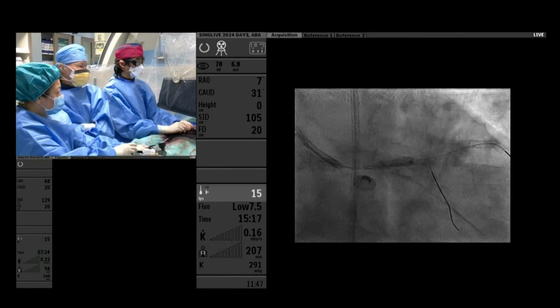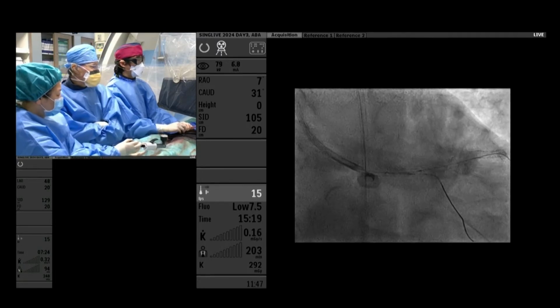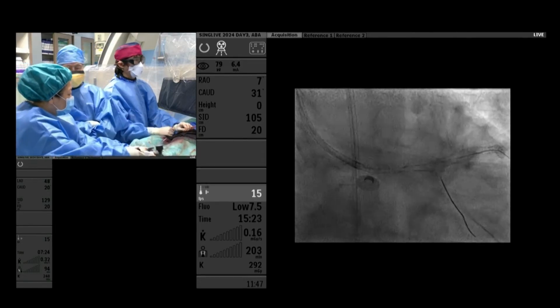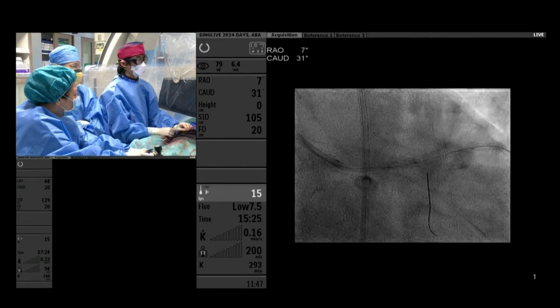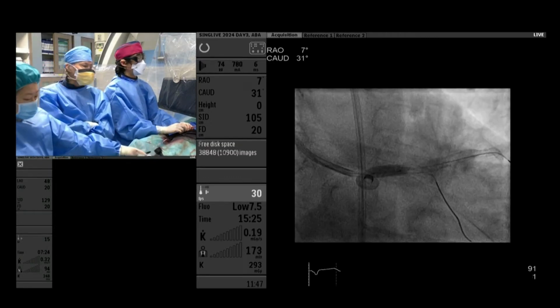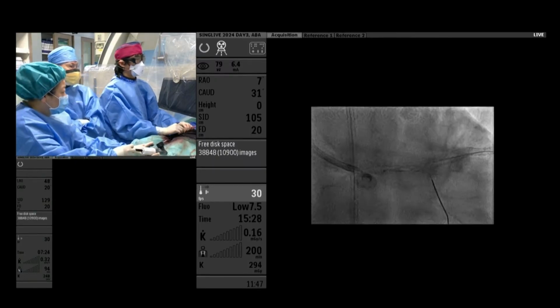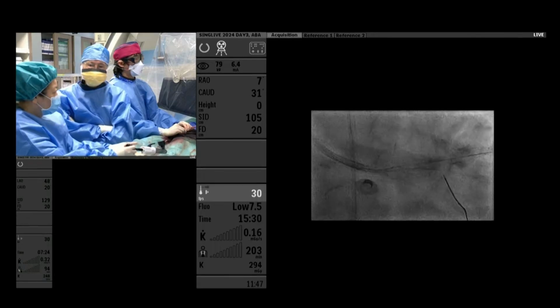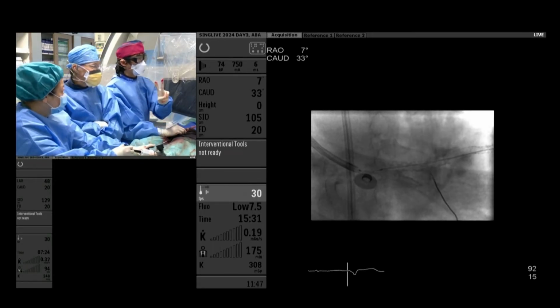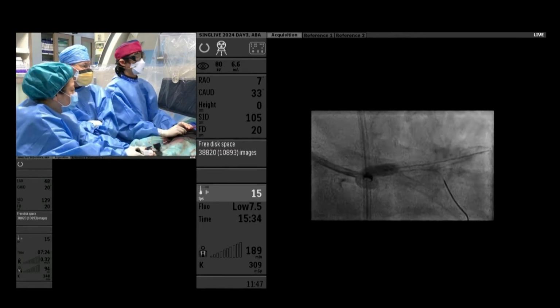Alan, any experience? No, I think for really low dose contrast, I almost never inject contrast until the end. As I mentioned, some of the panelists said, it depends on the patient's symptoms, EKG changes, hemodynamic compromise, and it always depends on IVUS. If IVUS is clear, nothing goes wrong, there's no edge issues, and the stent is going up. Then the most difficult part is whether the side branch, especially in this case.